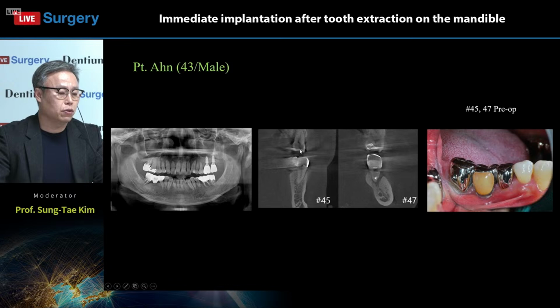At 45, when we are placing an implant in the buccolingual relationship, we have to evaluate where the large amount of bone is located. I don't think we have any problem placing an implant in 45, aiming the axis of the implant at the inner incline of the functional cusp of the opposing dentition. So the axis is like that. For 47, we also place the implant in this way.